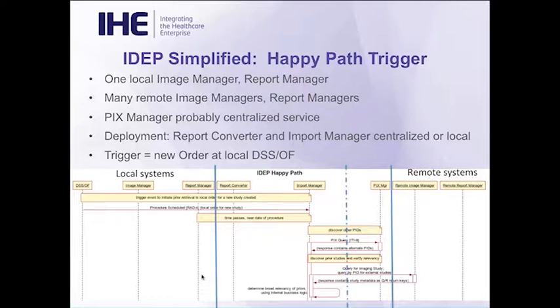All right. The sequence diagrams for IDEP are long, because there's a lot of things going on and there's a lot of different transactions between a lot of different systems. It is not my intent to walk through every sequence diagram that we've done because there are too many. So instead, we're just going to walk through the happy path, and my intent is to introduce all the sequence diagrams, introduce the steps, as opposed to walk through all of the different transactions.